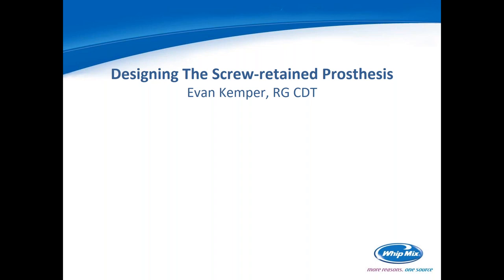Okay, Evan, we have another question. What brand of printer prints soft tissue? Well, the Asiga DLP printers that we have will print it. Now, we don't make our own soft tissue material, but it's an open material printer, so it can use any DLP print material that prints at 385 nanometer. So NextDent makes one, which they make materials for DLP printers. I'm trying to think if any of the other big open material companies have soft tissue. I don't think they do.